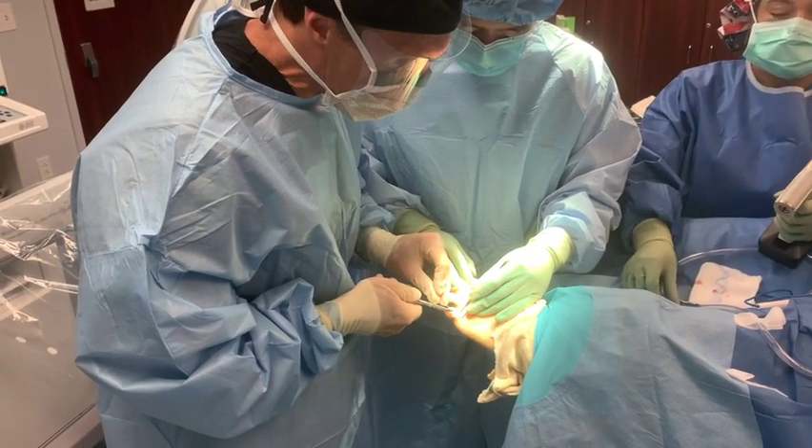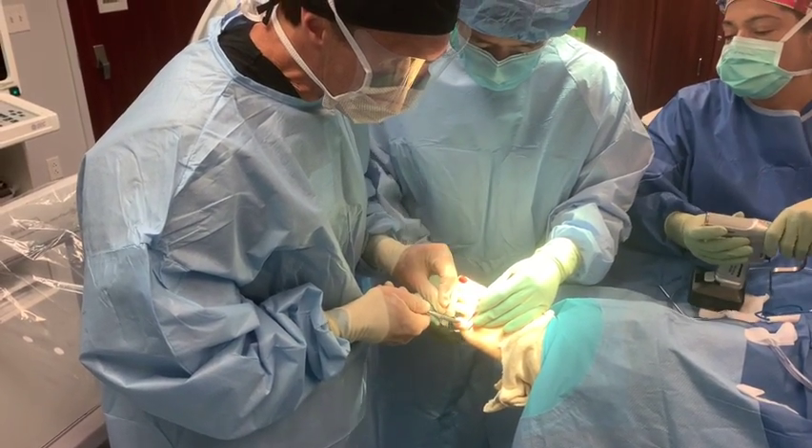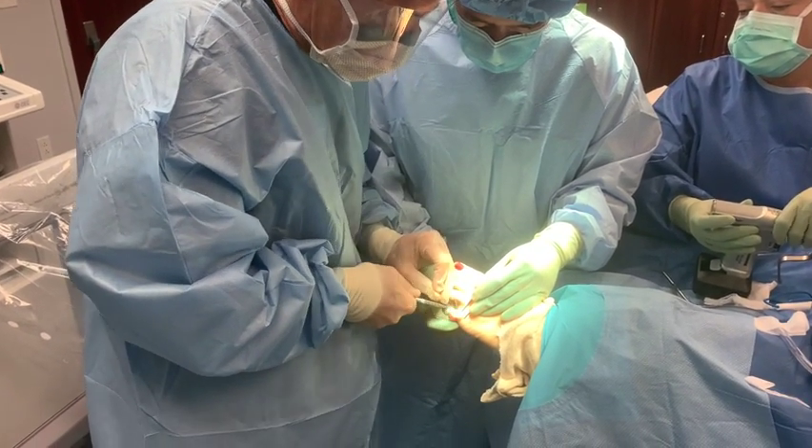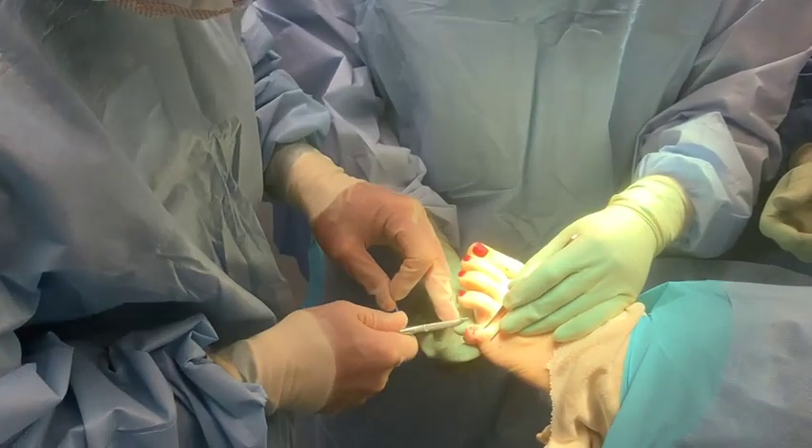If you press fit it and you cut this at kind of an angle — a very sharp angle like this — the cutter cuts very easily. You can see that sharp angle right there.